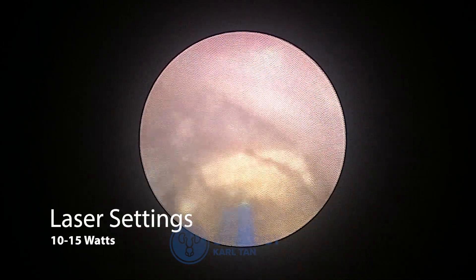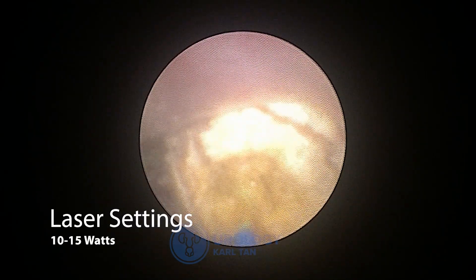Usually with the ureter, you should not increase your settings above 10 watts. The maximum should be around 12 or 15 watts.